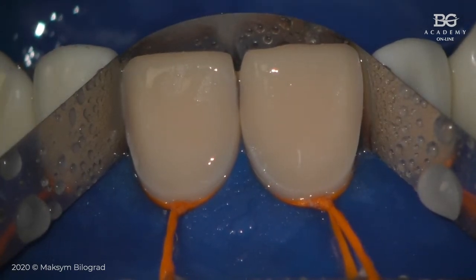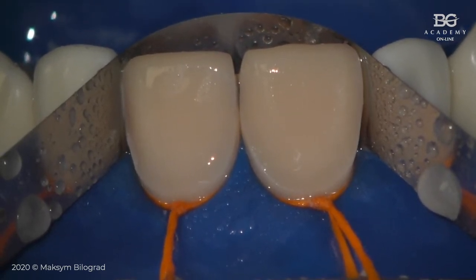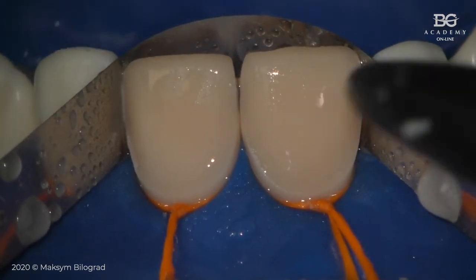That's it. It is enough to get proper sandblasting, just few seconds, and to get the surface ready for bonding. Okay.